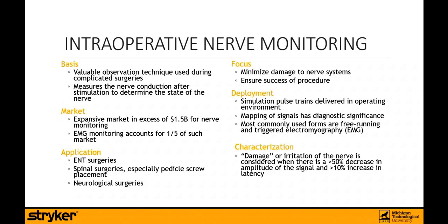Our team was tasked with intraoperative EMG waveform identification, which revolves around the principles of intraoperative nerve monitoring. The basis of IOM, for short, is that it is a valuable observation technique that gets used during complicated surgeries to determine the state of the nerve.